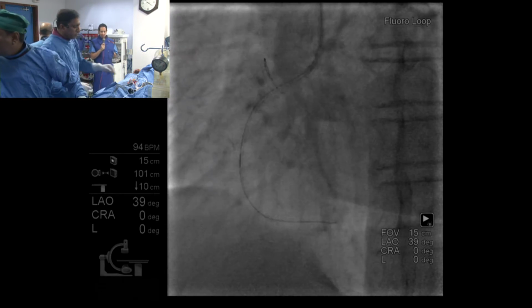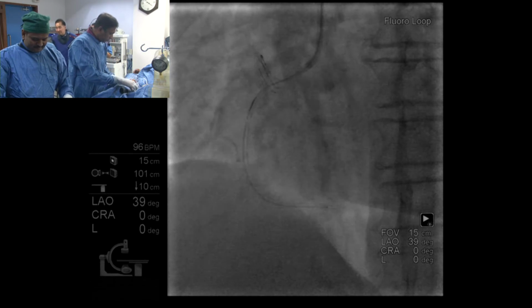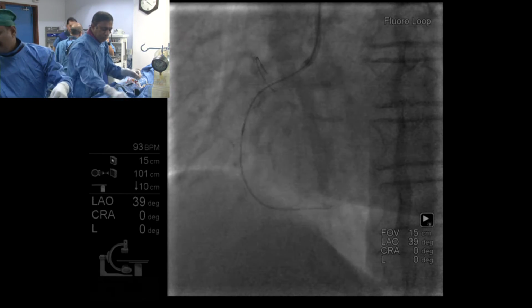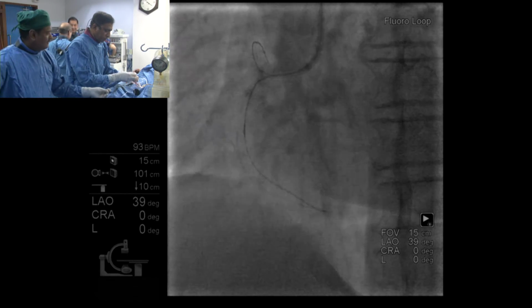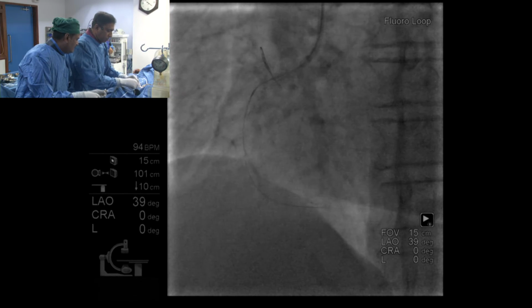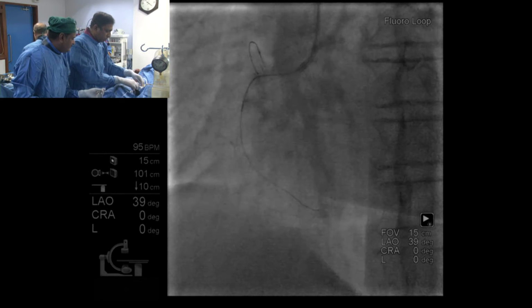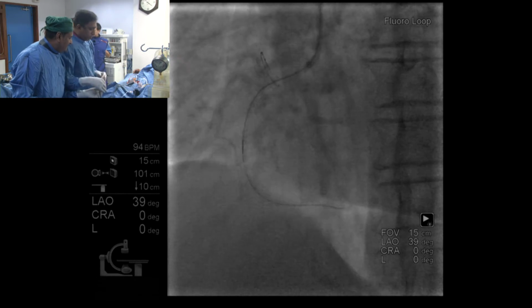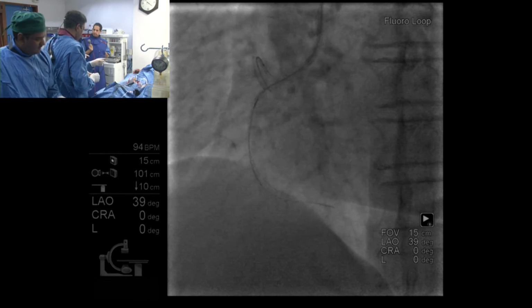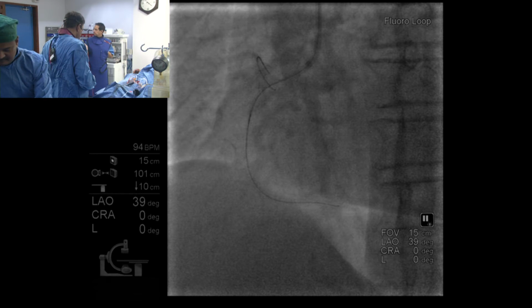Panel comments on microcatheter choice: which is the most popular microcatheter in the United States? Many different ones: Caravel, Turnpike, Corsair. How do you choose? I think when the lesion is very calcified, I'm nervous with the Caravel. Okay, your experience, we want to learn from you. Mostly I'm using Finecross, so I do not have so much experience using this one.